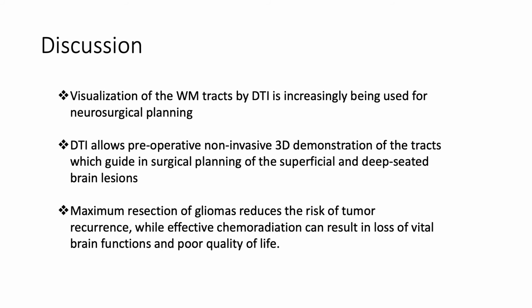By combining the data with other studies, the authors of this paper found the extent of tumor resection and post-operative improvement of locomotive function of the GT group to be significantly higher than those of the control group. This case study provided the imaging of this technique and showed why it is useful in preoperative planning.